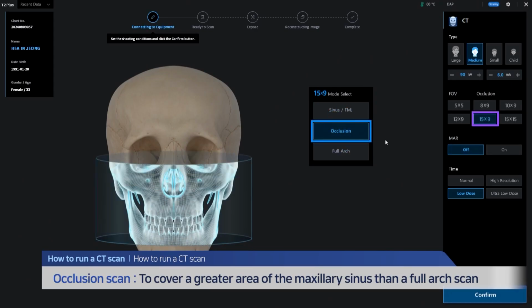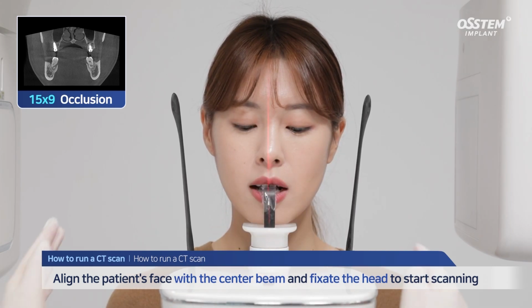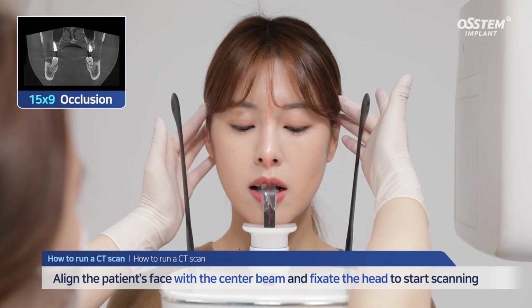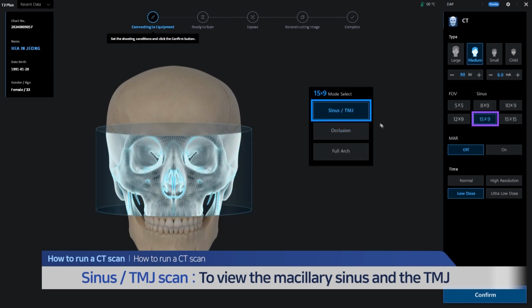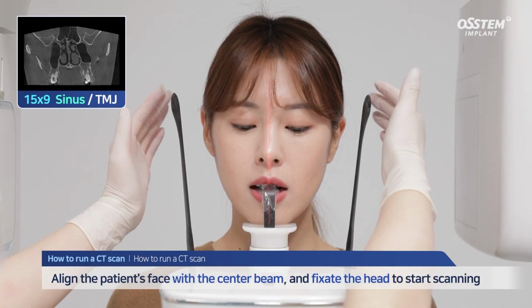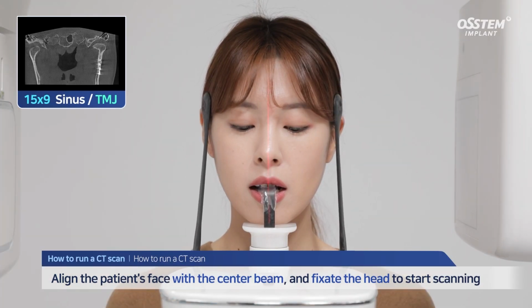An occlusion scan is able to cover a greater area of the maxillary sinus than a full arch scan. Since the equipment provides the height set for scan, align the patient's face with the center beam to fixate the head to start scanning. Sinus and TMJ scans are used to view the maxillary sinus and the TMJ. Since the equipment provides the set level for scanning, align the patient's face with the center beam and fixate the head to start scanning.